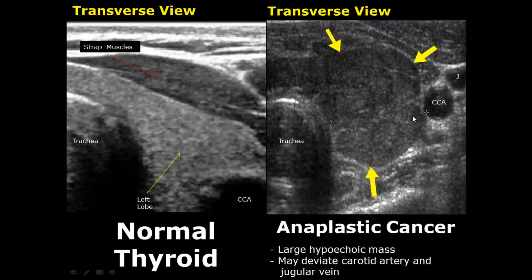Anaplastic cancers are larger in size, which helps differentiate them from other cancers. They appear hypoechoic and can also deviate the common carotid artery and the internal jugular vein.